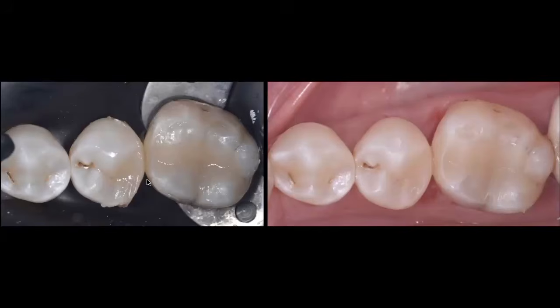So I know you have these cases in your practice. I know that this clinical approach using this Garrison systems, either the 3D or the quad system, is going to be very helpful for you in your daily clinical practice, because we do class twos almost every single day in our office, and I don't think that your office would be any different from ours.